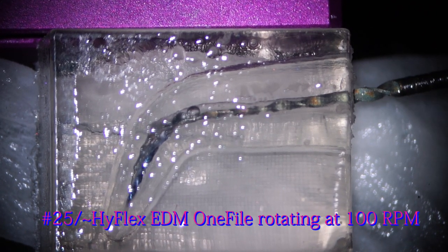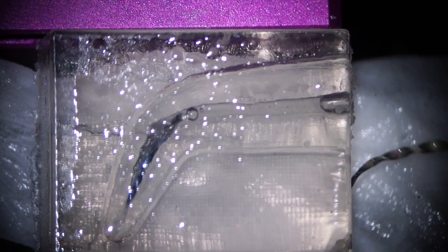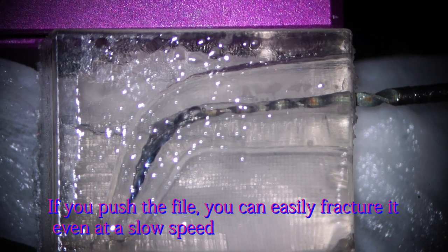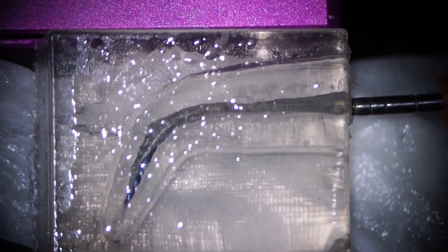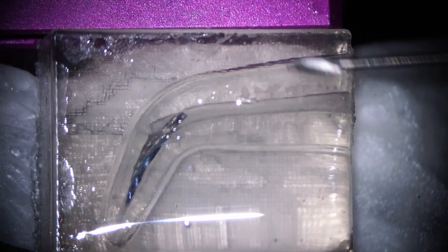This one is the third one. If you rotate a small instrument at a slow speed like 100 RPM and push it a little bit hard, then you can easily break it. So it's rotating at 100 RPM and it was broken.